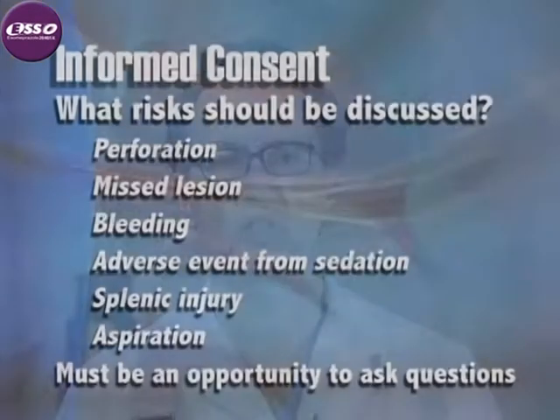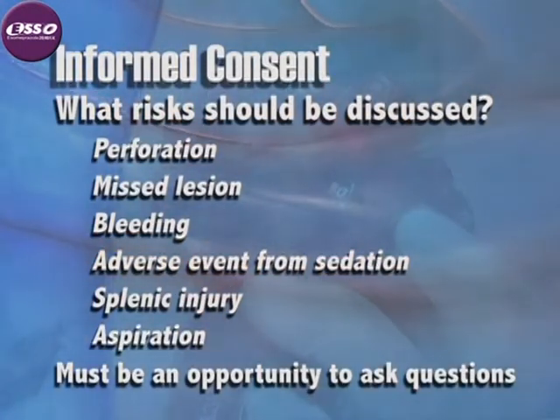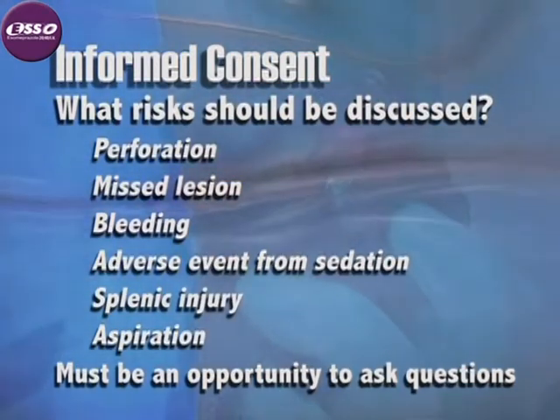Endoscopists typically do not know their miss rates. They should be able to respond to patient queries about their skills in mucosal detection by giving their personal adenoma detection rates. It is perfectly reasonable for a patient contemplating colonoscopy to ask their potential colonoscopist for their adenoma detection rate. There also should be a discussion of the risk of bleeding, which is essentially confined to polypectomy, reaction to the sedative medications used, and there should be an opportunity to ask questions. Here's the whole process as I do it.